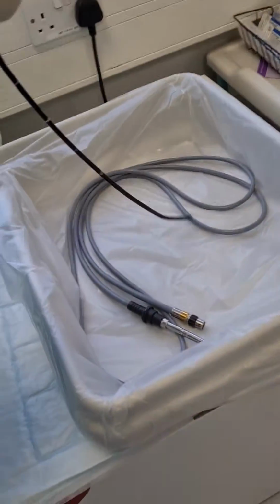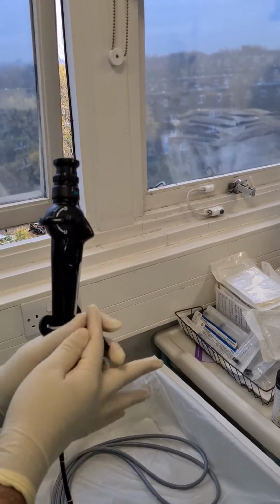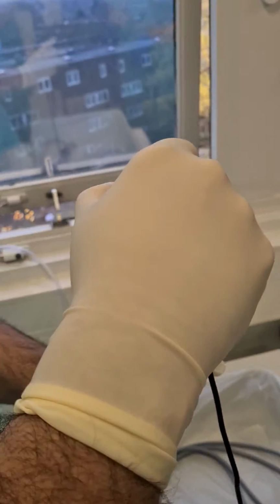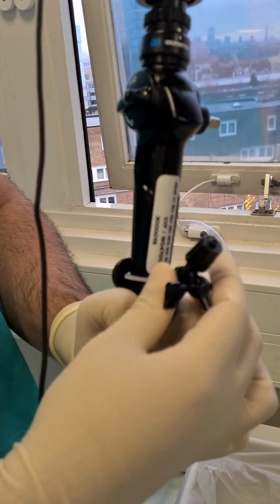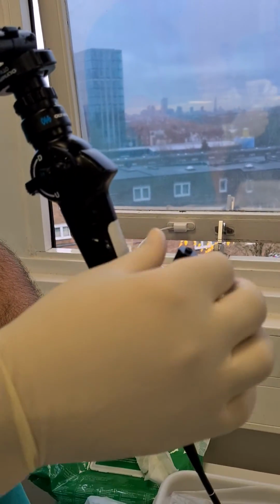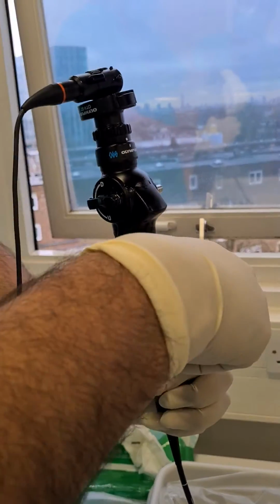So what we do here, we attach the working channel here. If we want to attach the camera here, the camera will go like this, and this is the port for the working channel. So if we attach the working channel here, it's a luer lock mechanism like anything else. And if we open this, the guide wire and the stent removing forceps go from here.